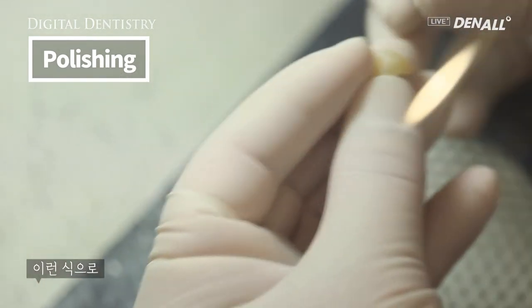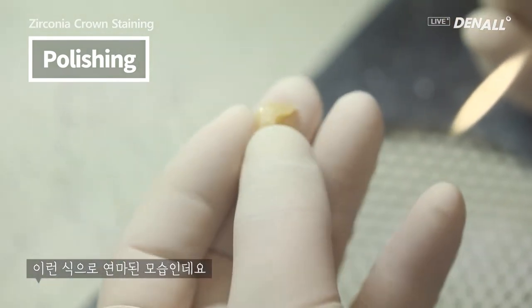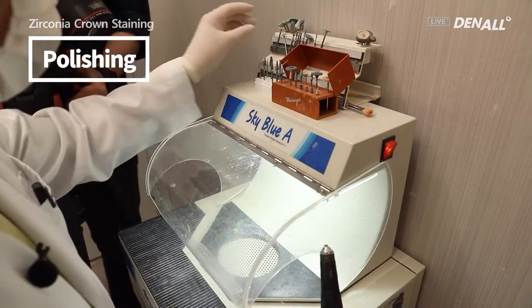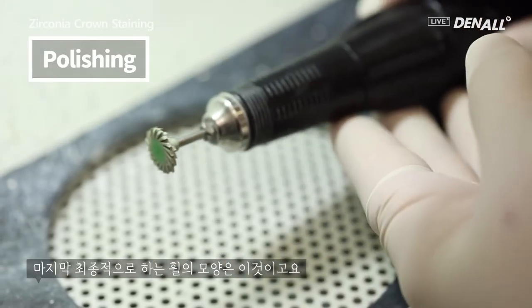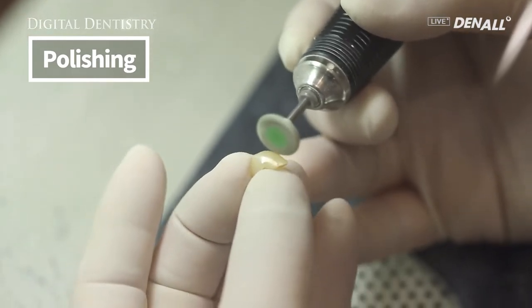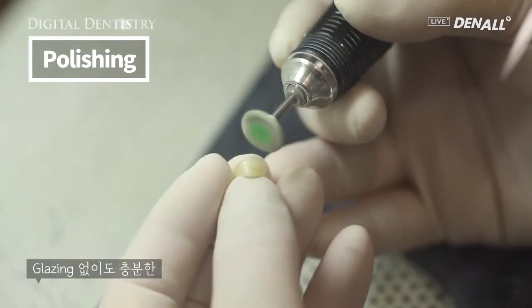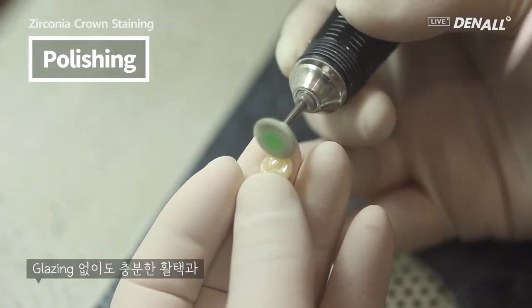Like this, it is polished. You can see it is shining. This is the last wheel that is used. Without glazing, sufficient smoothening and sheen can be achieved.